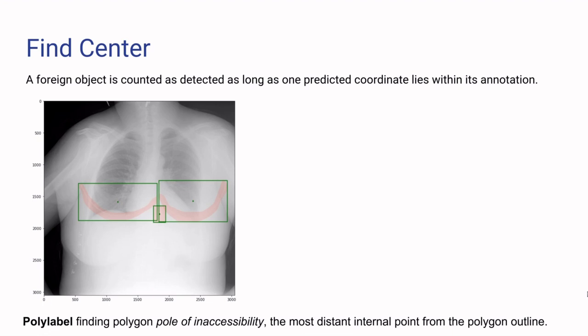That will result in bad FROC performance, because our detected bounding box center will be outside of the annotation, and FROC is calculated by whether the coordinates lie within the annotation or not.